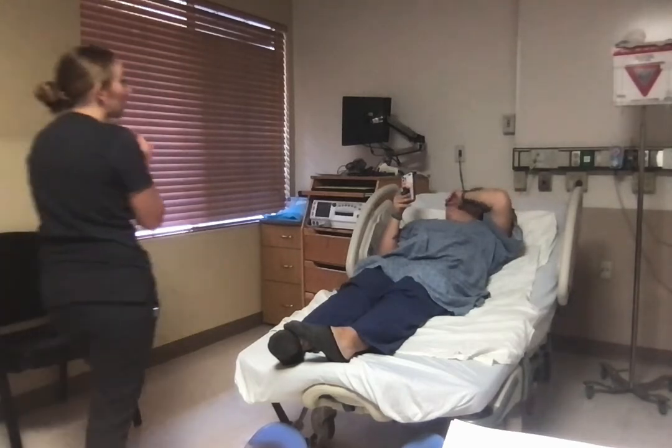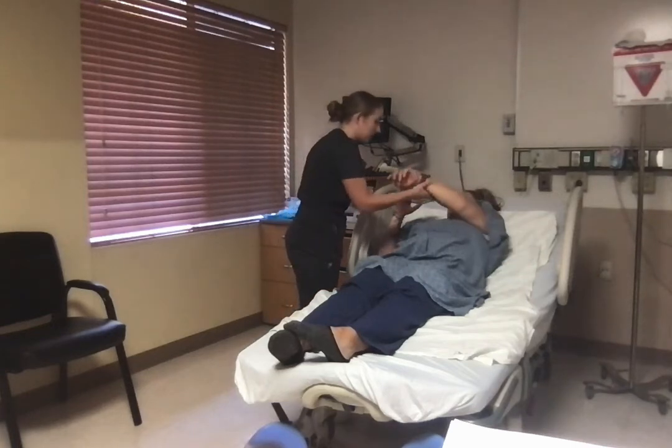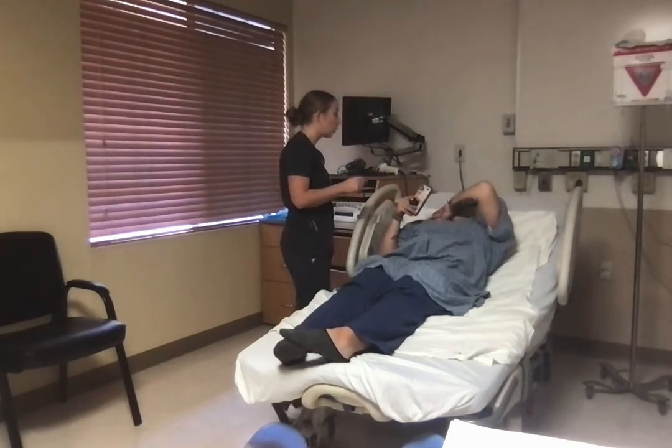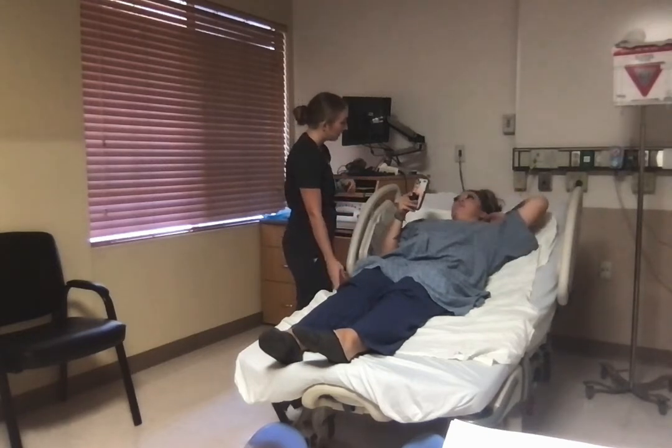Hi, my name's Rebecca. I'm going to be your nurse today. Can you go ahead and give me your full name and your date of birth? Katie O'Connor, 1985. Okay, Katie, so I'm coming in right now because your baby is having some decelerations, and what I need to do is go ahead and position you on your left side. Okay, my baby's okay though, right?